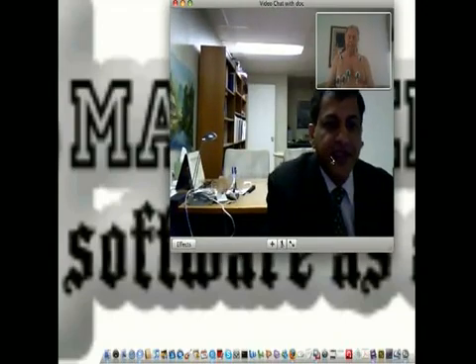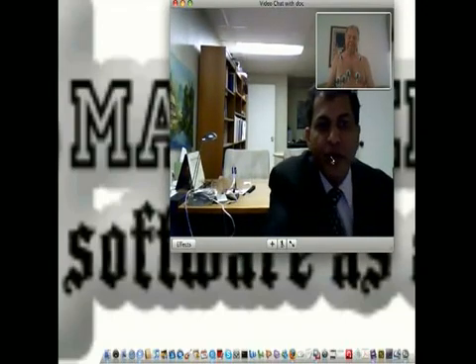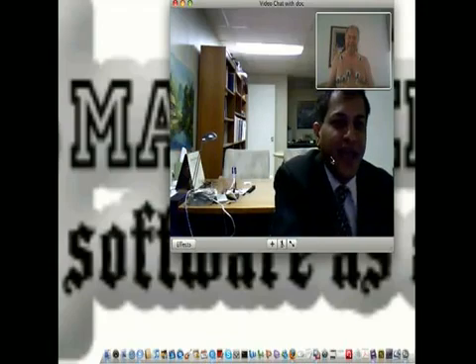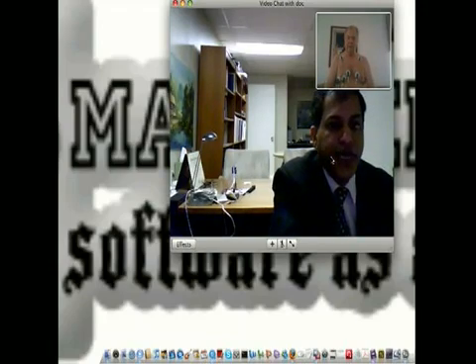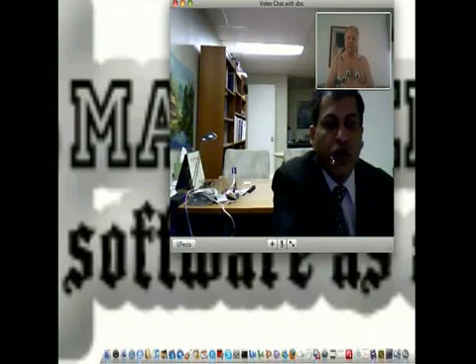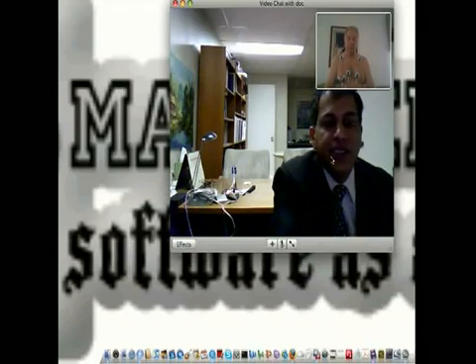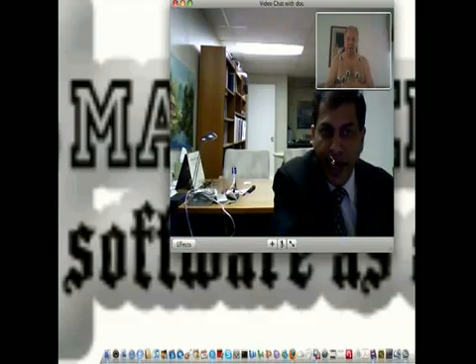Hi Roger. Hi Asmat. We're going to do a remote EKG on you. The last thing didn't go that well, so I'd like to do a remote EKG and demonstrate to the doctors how easy it is to connect remotely and securely.